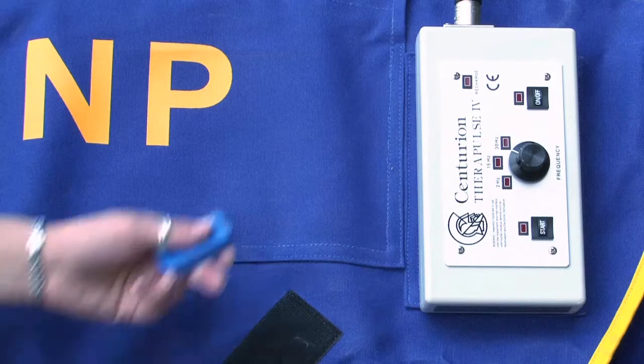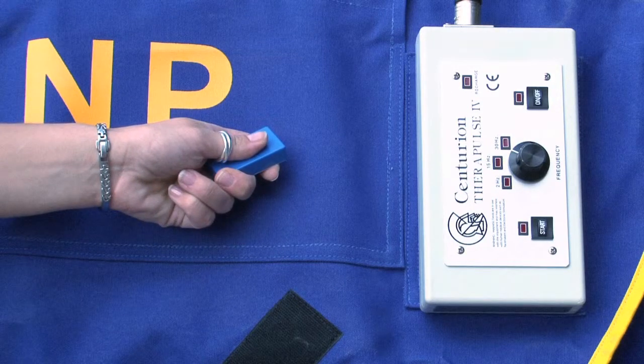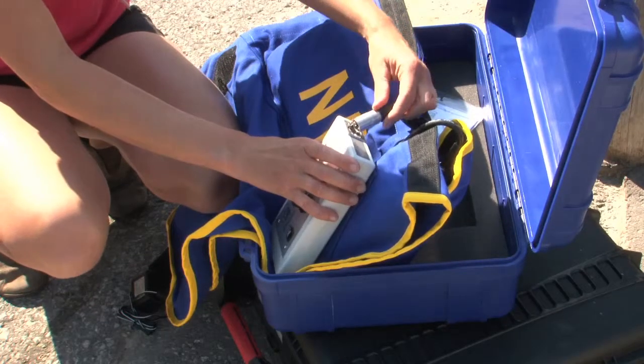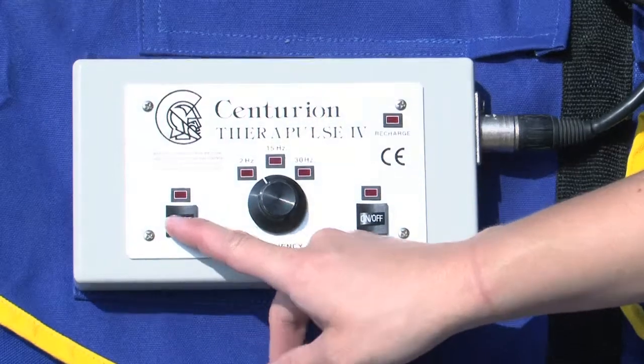To test whether the unit is working, hold a magnet up to one of the coils in the neckpiece. If it is working properly, you will feel the magnet pulsing. If you do not feel a pulse, make sure your controller and battery are connected to the appropriate cables and that the start button has been pushed.